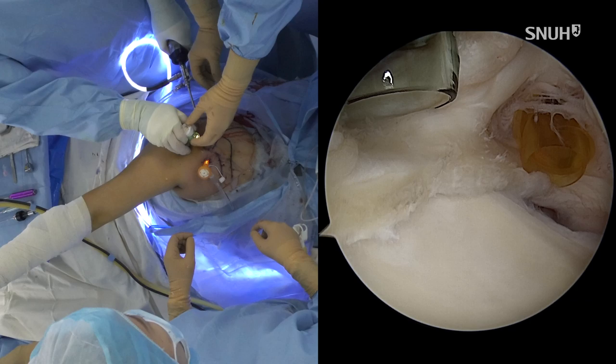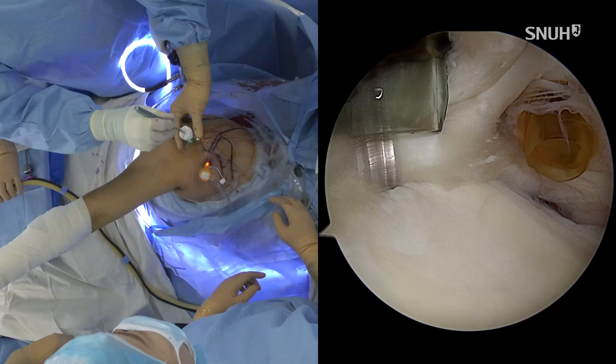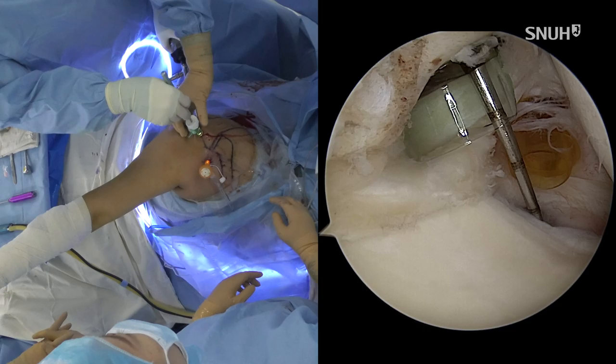As I said before, my fixation of the superior labrum is around here and here. So 12 o'clock, or 11 to 10 o'clock position. For the easiness, I usually do the posterior fixation first, and then the anterior fixation. I don't go to the 1 o'clock or 2 o'clock position.